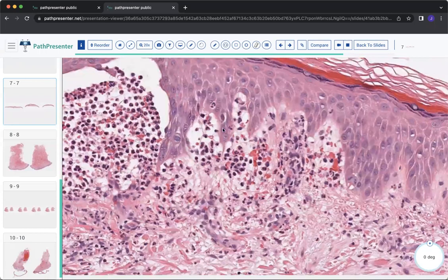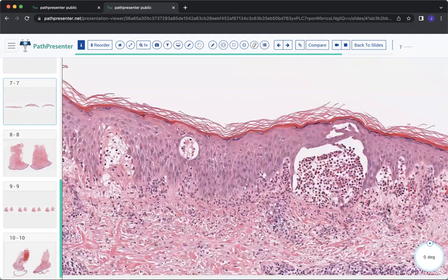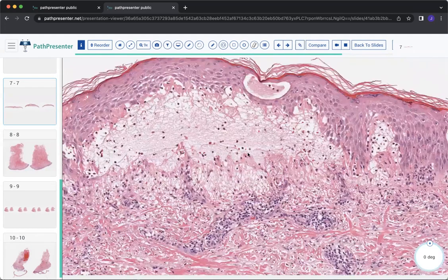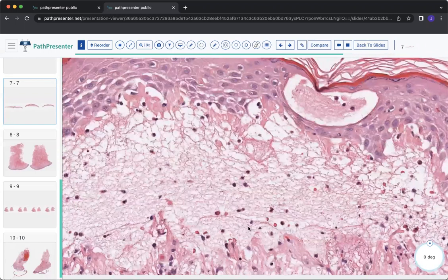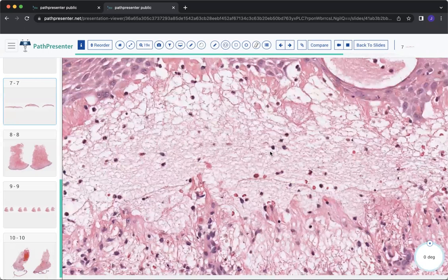And so this is where the pathology starts, right? This is where you're having some type of autoimmune granular deposition of IgA, and that's what you're going to find on the DIF. And as it progresses and as you have detachment, you're going to have more of a reticular degeneration like this. So depending on how long the epidermis has been detached, it's going to start dying off here.